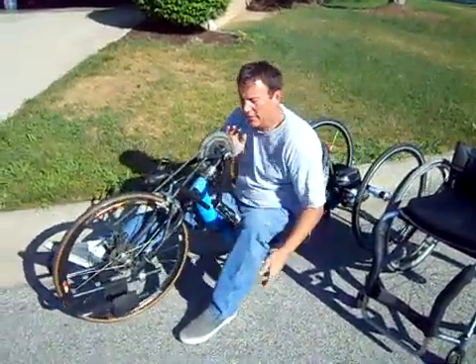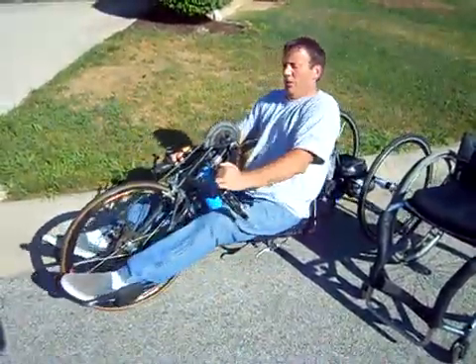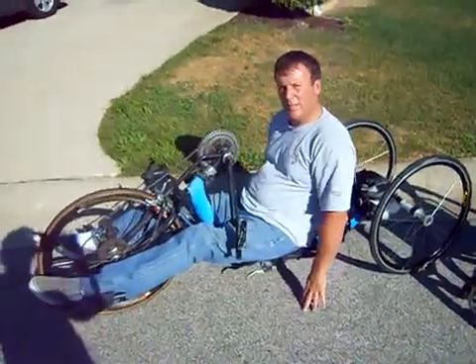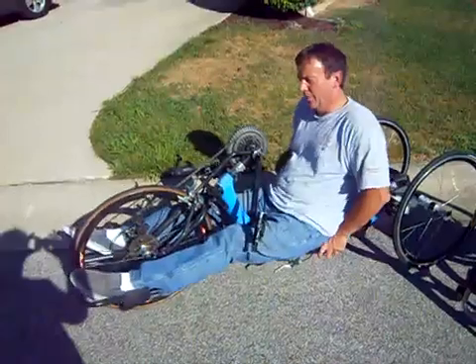Put your legs in the foot support, and then once you're in, strap your feet in. That's easy to get some help to be able to do that.